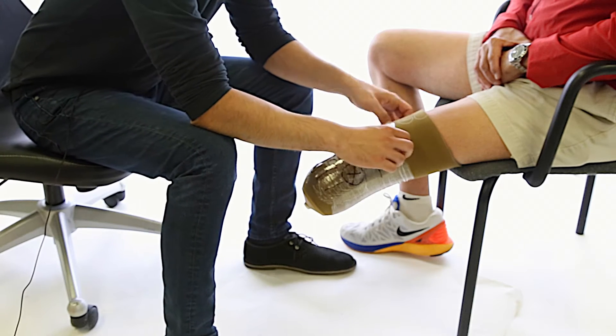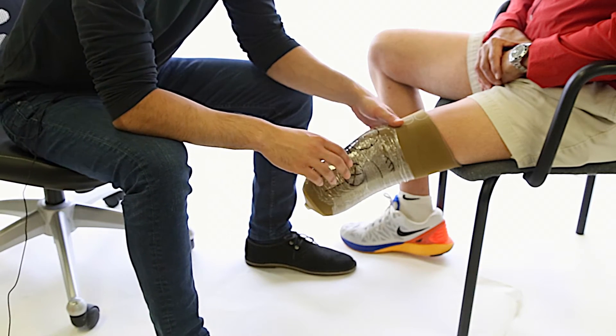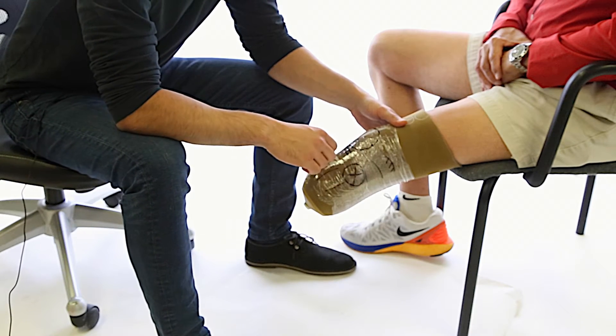We're going to be talking about the evaluation and the questions to ask when doing an infinite trans-tibial socket, the measurements to take, and everything to do before casting.